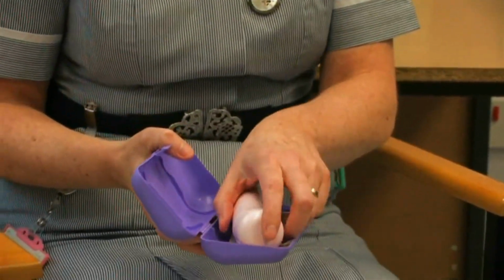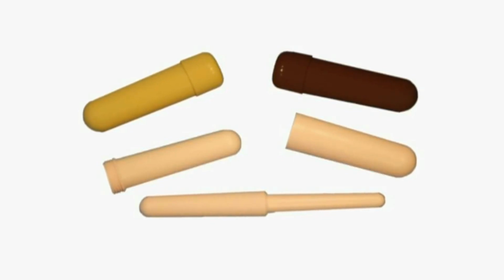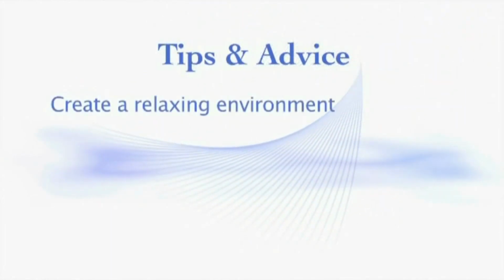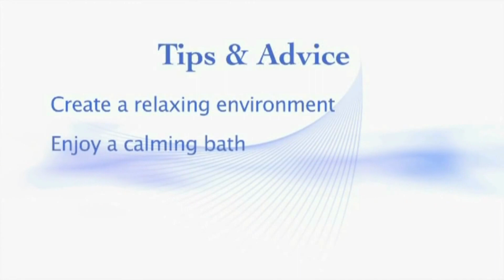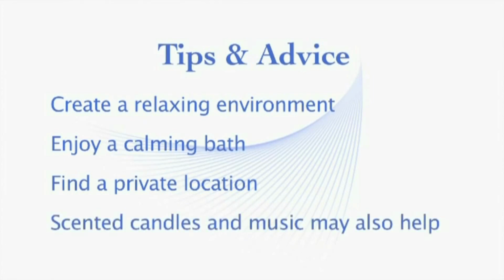The Femax Dilator comes in a discreet case and is available in a choice of colours: pink, beige or brown. You should always use your Femax Vaginal Dilator or trainer as advised by your health professional. You may want to follow these tips to aid relaxation when using your dilator. Create a relaxing environment. You may find it helpful to have a relaxing bath first. Choose a private place in your home, away from distractions or interruptions. Scented candles may help to create a relaxing atmosphere. Playing your choice of relaxing music may also help.